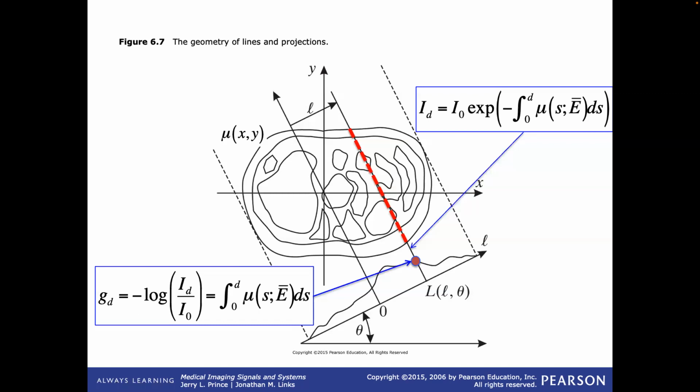Well, hallelujah, right? This is awesome because our image is going to be an image of linear attenuation coefficients as a function of position in the sample. That's what our picture is, right? And so bone, if it has a lot of linear attenuation coefficient, its value is high, it shows up as a bright pixel in the image. Air, which doesn't attenuate X-rays at all, basically shows up as a very dark pixel. So because mu for air is pretty well 0, right? So this is the fundamental physics of the situation.